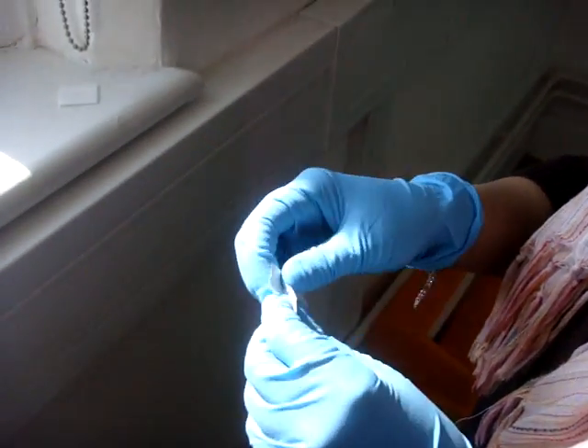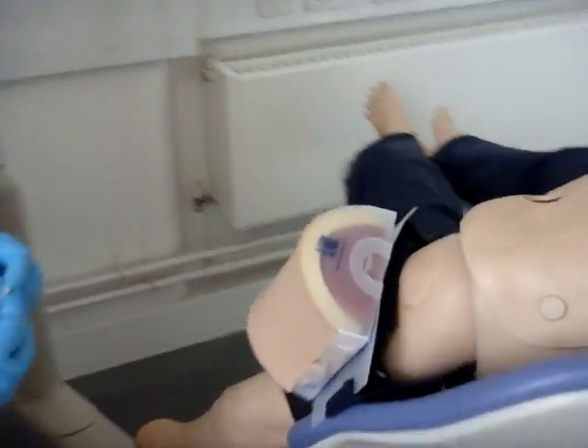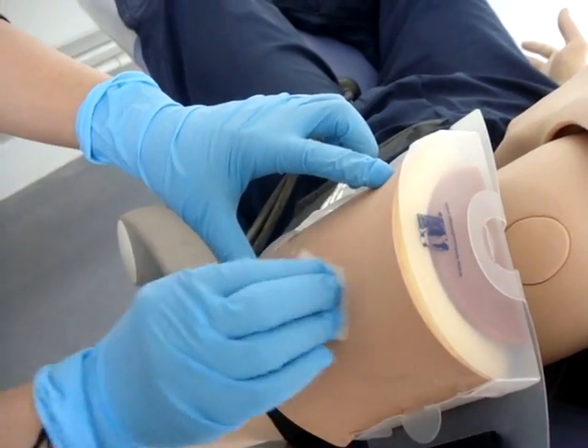First, open the alcoholic swab. Then swab the deltoid of the arm. Before you insert the needle, ensure that the alcohol has dried off.